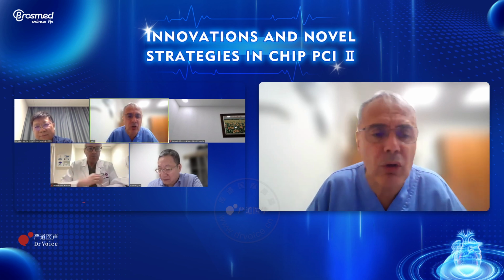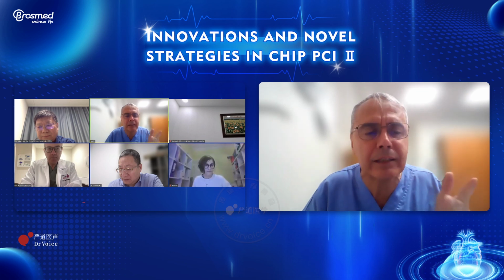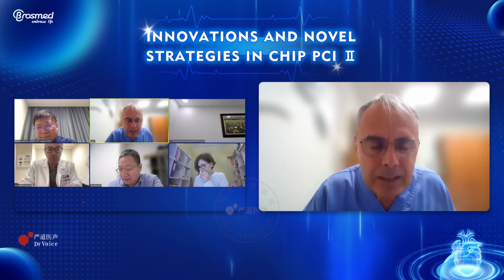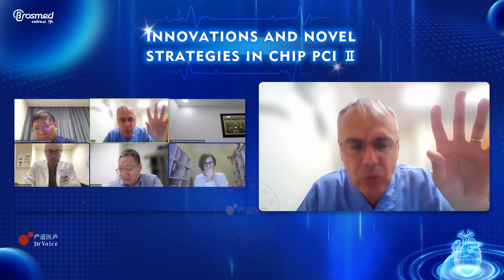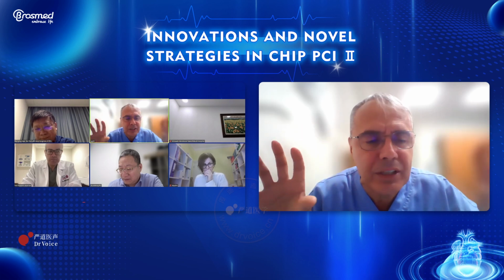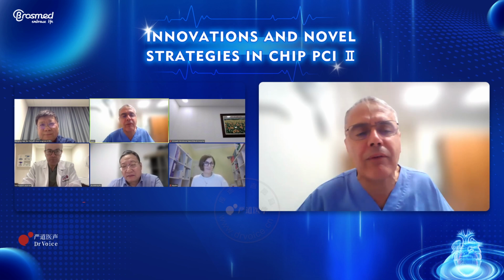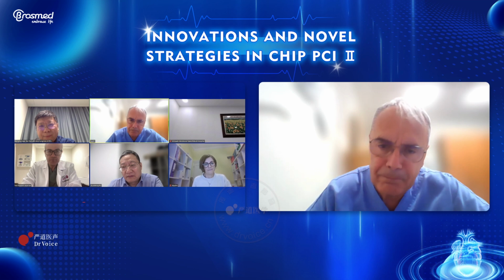If you use Sequent Please or Prevail, it's very important to define very well the type of the balloon, the type of drug, and the type. Nevertheless, I don't believe in the differentiation into sirolimus or paclitaxel, but in the future, probably we use the typical balloon, because sometimes with the same drug, the differences are very, very high. This is my comment. In Europe, my favorite sirolimus is Selution. My favorite paclitaxel is Prevail and the Sequent Please, honestly speaking.